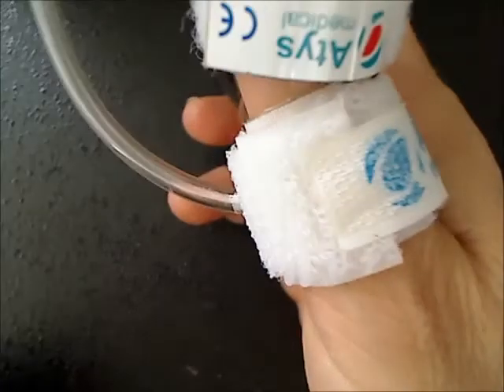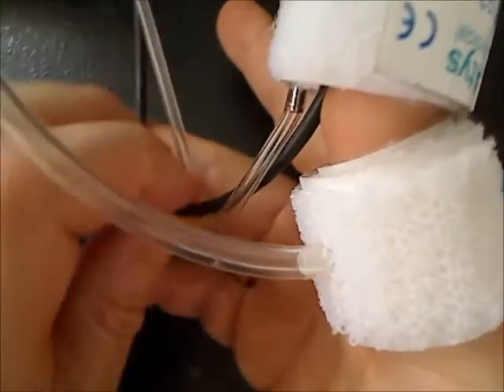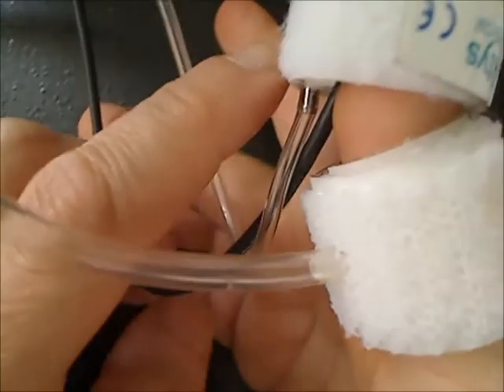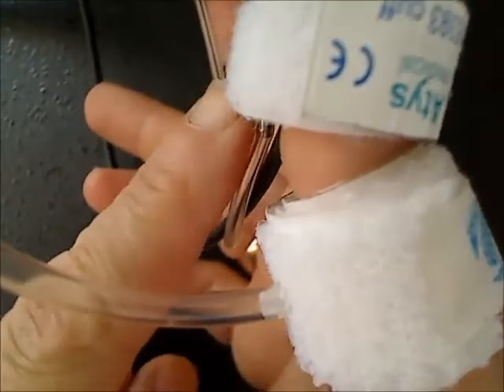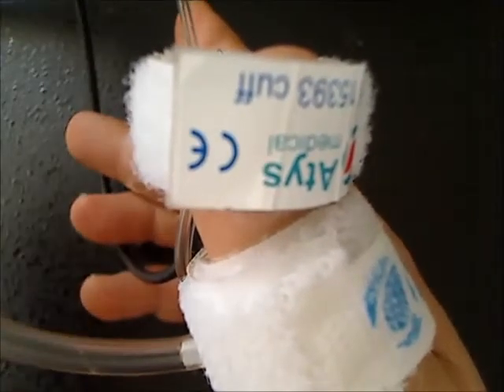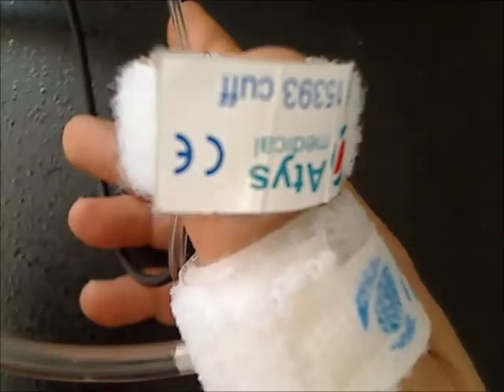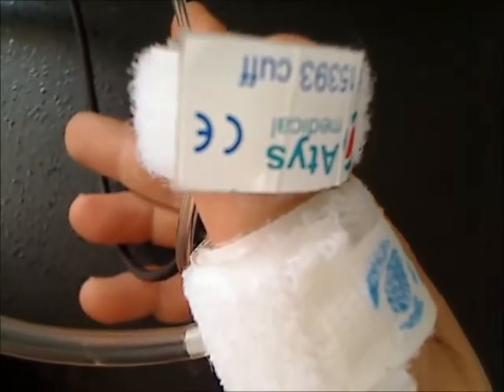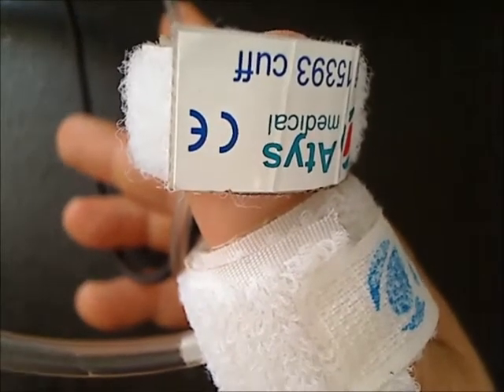Please note that the sensor cable must go downwards. It must not go upwards. If it goes upwards, it is likely to pull the sensor away from the toe, and in this case the SysToe is likely to collect parasitic signals.